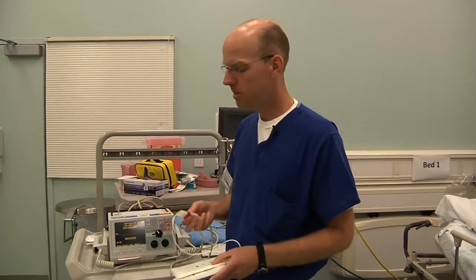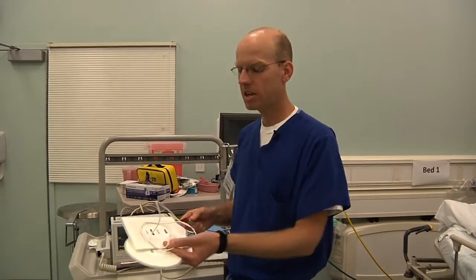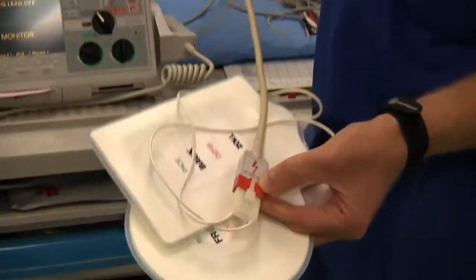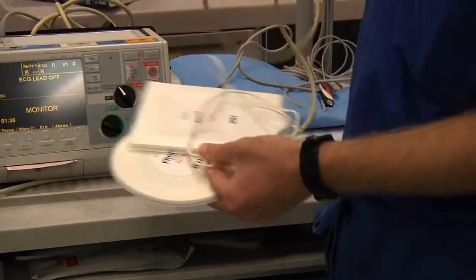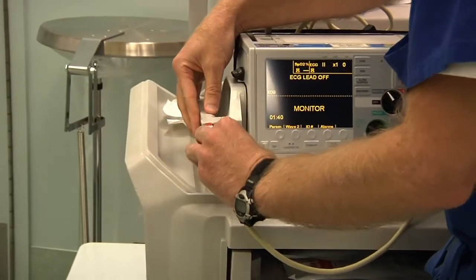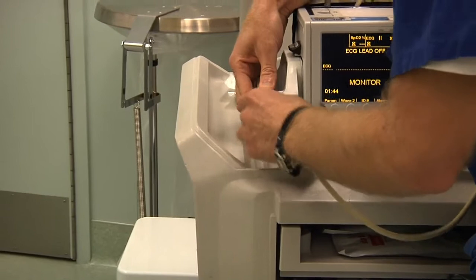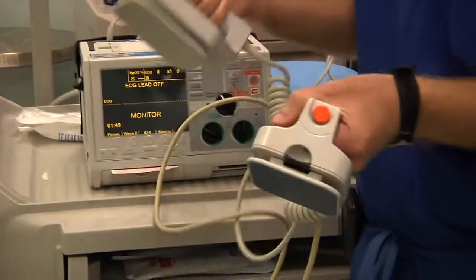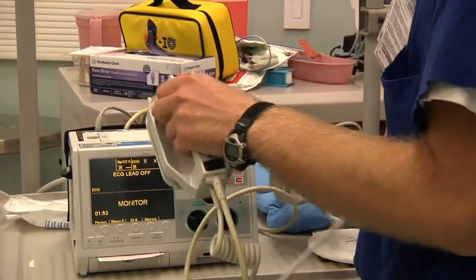Now, this machine has the ability to switch back and forth. So these come in a box, and then you connect them to the therapy cable, which then connects to the defibrillator. If you're going to use the paddles, you have to put this in here like this. It slides in, and now you're able to use the paddles. Now, once again, these are not the preferred. You're preferred to use the pads, not the paddles.